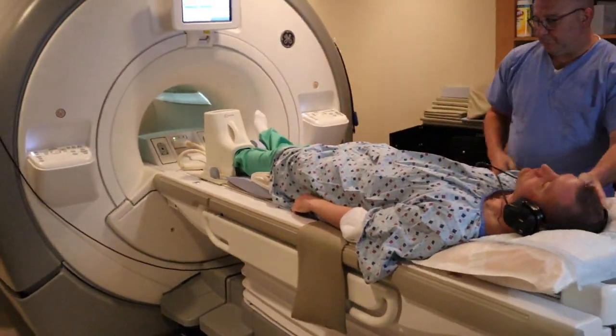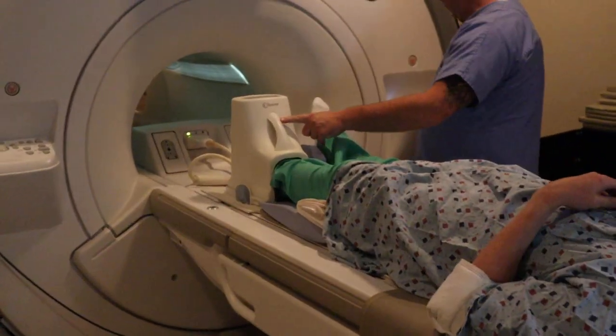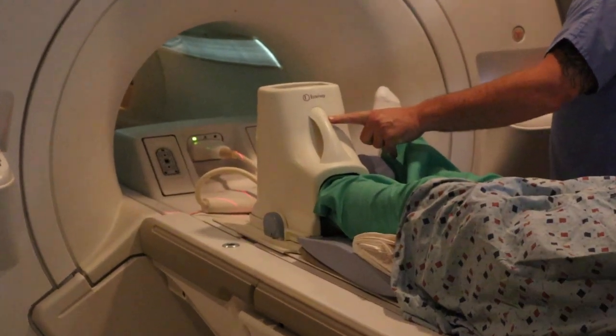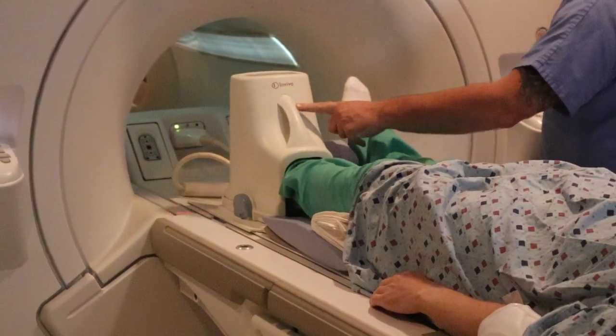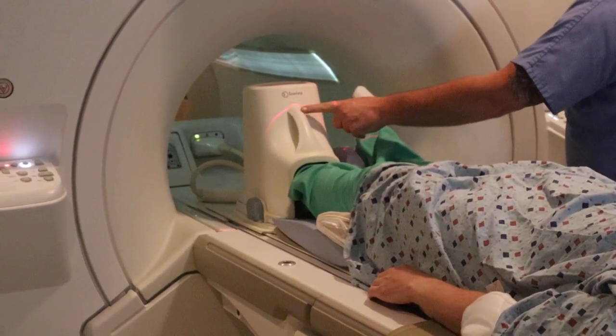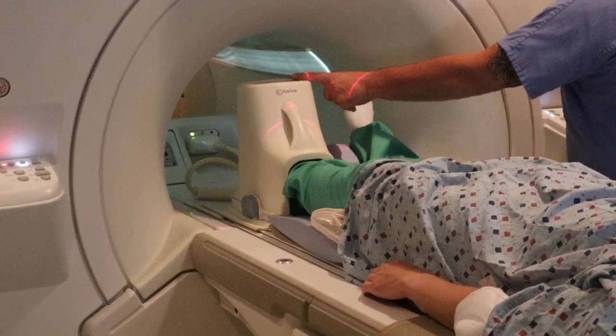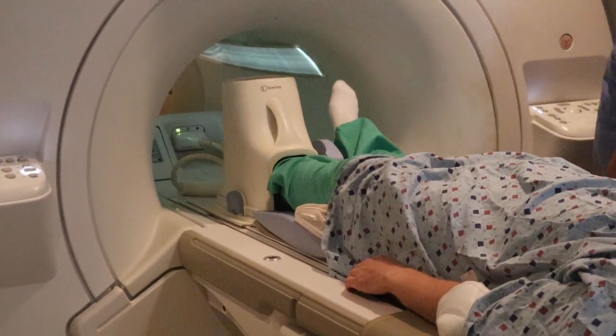You're going to provide a headset for the patient. You're going to position for the ankle. And if you're positioning for the foot, you're going to put that alignment light right on the toes. Then advance to scan.